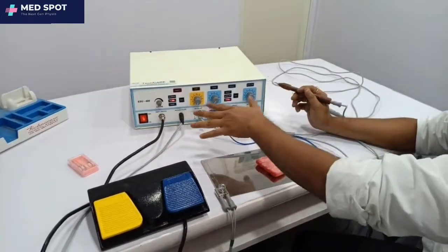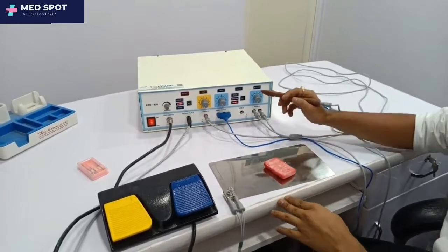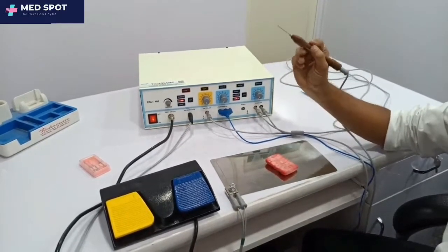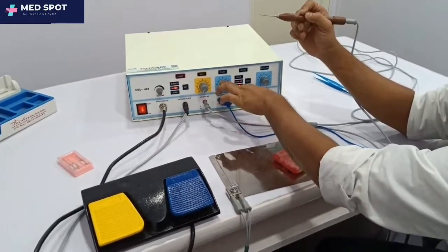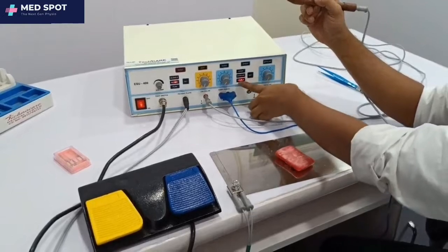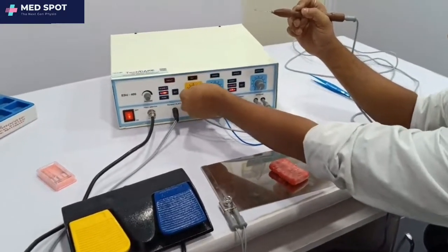Now all the accessories have been connected. We will start with the unipolar. This is the unipolar, and it operates for cut and coag. You can see on the display that the machine is in unipolar mode. First, we will show you the cut.